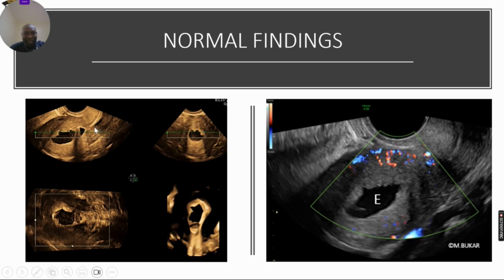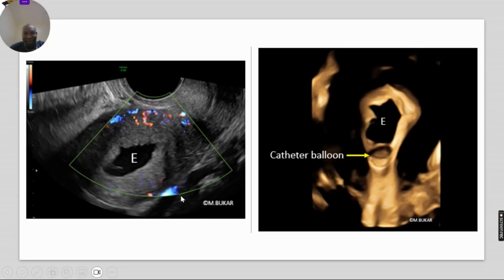For the same patient with thick endometrium who had saline infusion sonography, look at the asymmetrical endometrial cavity. On the rendered image, look at these endometrial folds. This is the 2D saline infusion sonography, and now this is the 3D saline infusion sonography with magnified images showing the asymmetry and endometrial folds on one side. On the 3D SIS you can also see the catheter balloon clearly.